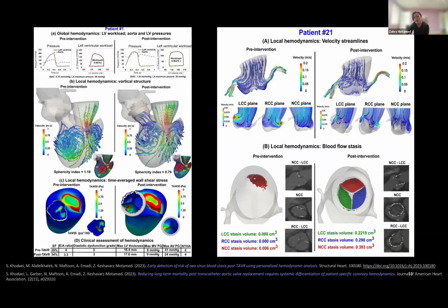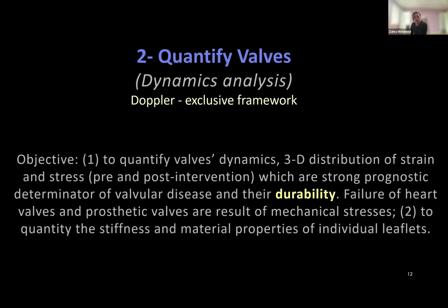So this is about the left ventricle: when we are discussing a transcatheter heart valve, either aortic valve or mitral valve, we should look at everything, upstream and downstream. This is a complicated situation, and only looking at Doppler echocardiography, we believe, underestimates the situation. So the premise that we have is that when we say quantifying the heart, we should quantify the valves, both valves, the ventricle, and also the vascular system as much as relevant.